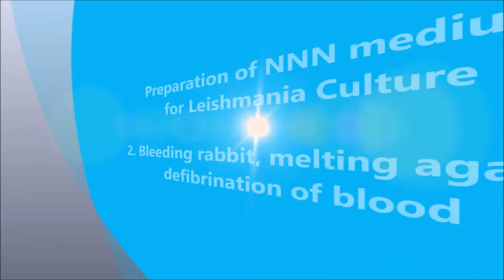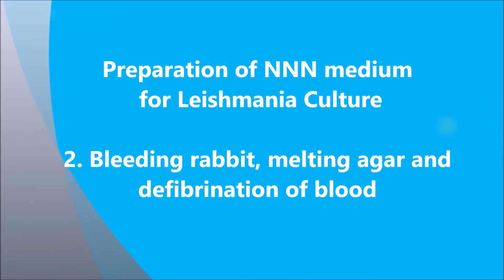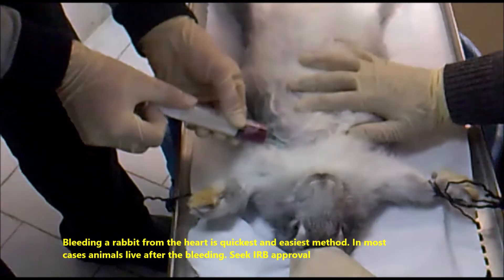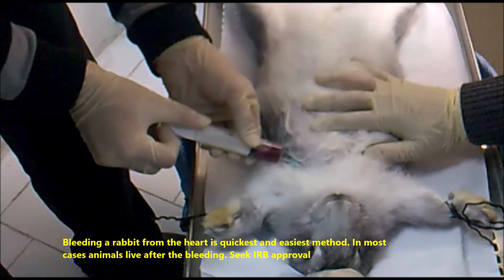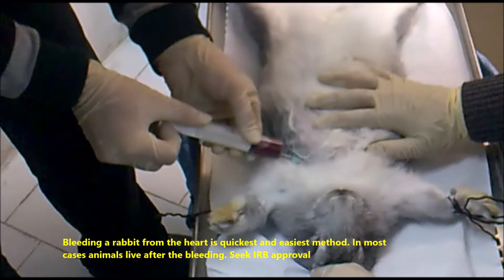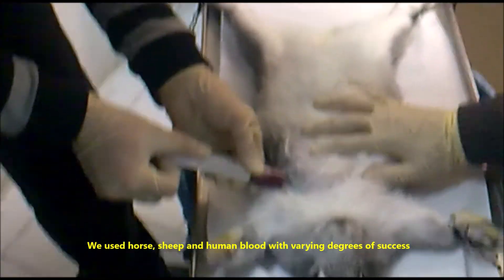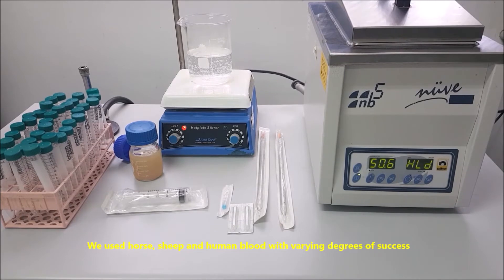Section 2: Bleeding rabbit, melting agar, and defibrination of blood. Bleeding a rabbit from the heart is the quickest and easiest method; in most cases animals live after the bleeding. Seek IRB approval. Horse, sheep, and human blood have also been used with varying degrees of success.